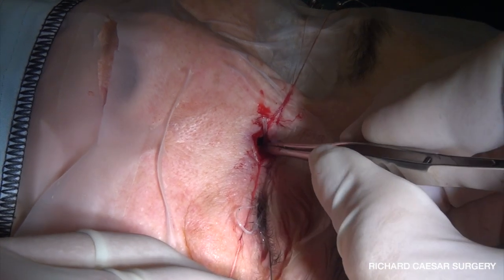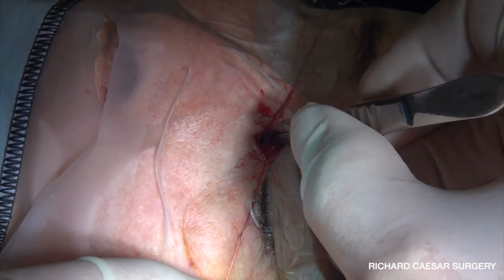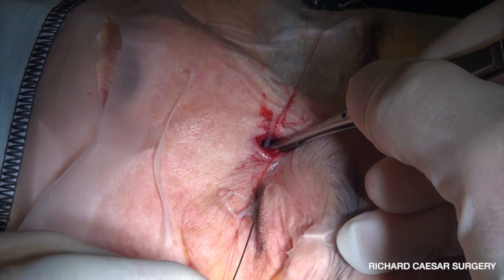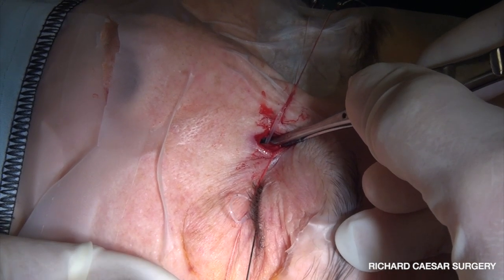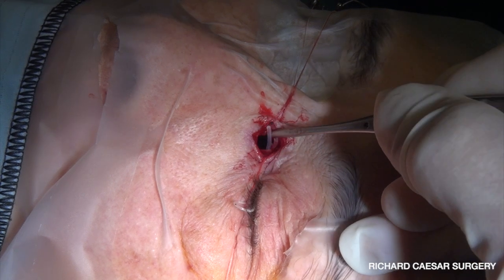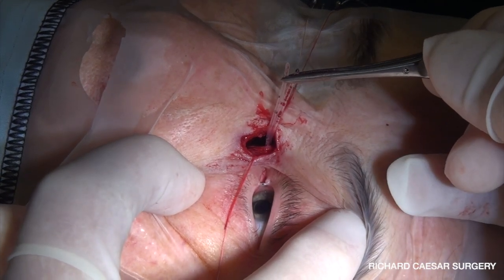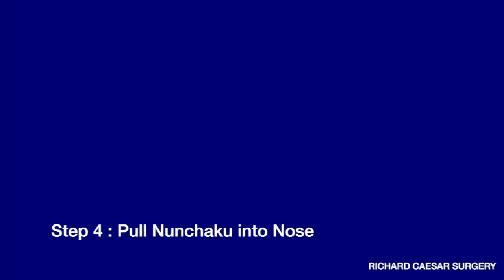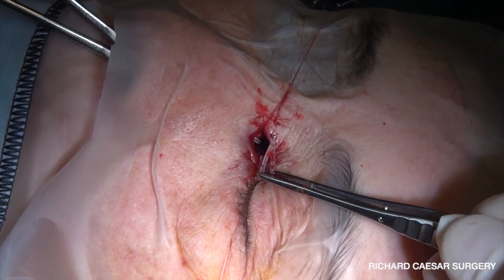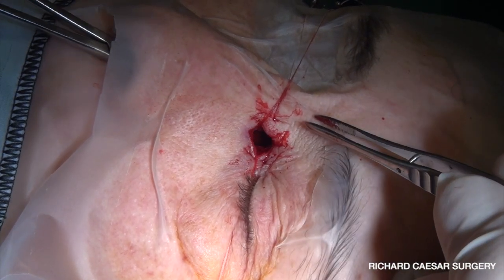With the Nunchaku you could simply carry on passing this down into your nasal space and then with a little twist it would release. For this video I'm demonstrating a more traditional way: removing the probe and then reaching up the nose to pass it into the jaws of an artery forcep. The Nunchaku has a little black dot which shows it's perfectly centered — you can see the little black dot sitting between the puncta, and you can also tell it's perfectly centered because the two silicon ends are equal length. The artery forcep goes up into the space you've made with your DCR, gets hold of the silicon and pulls it down.